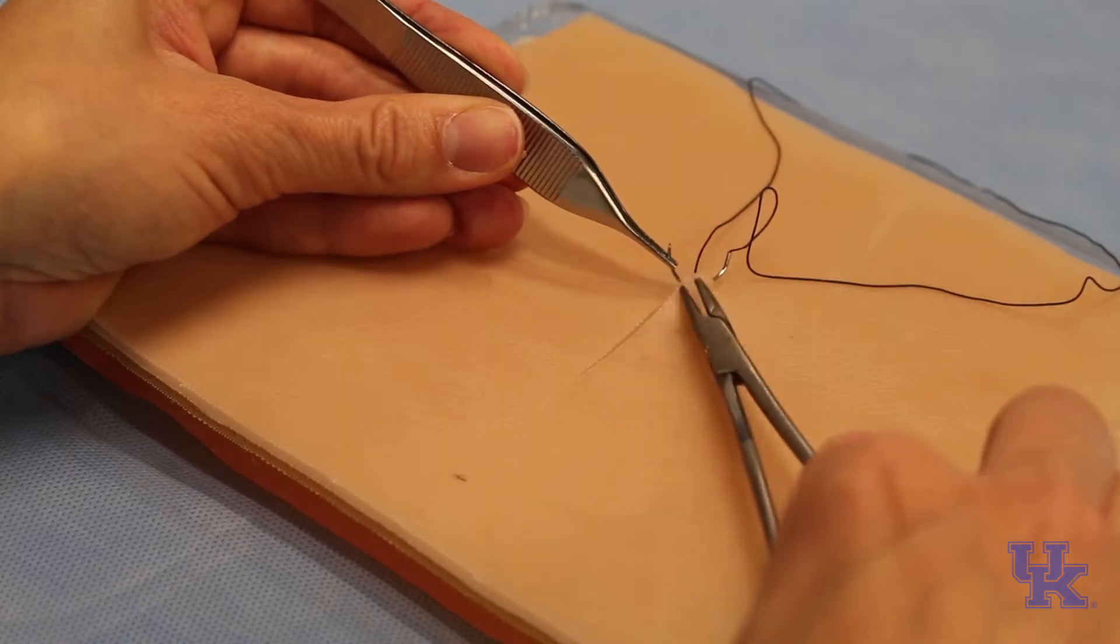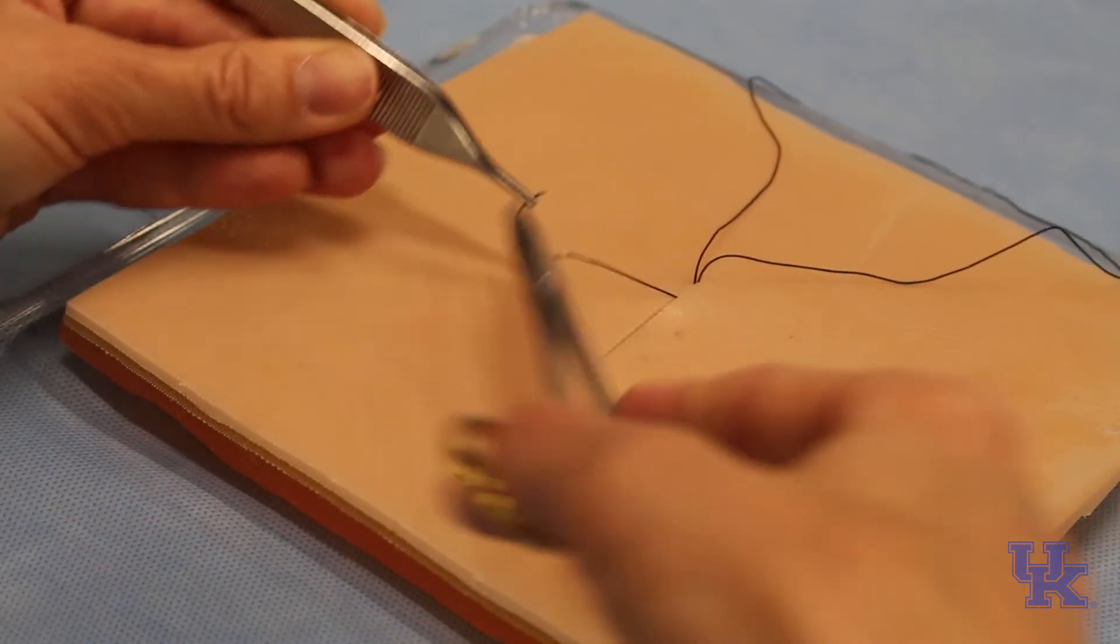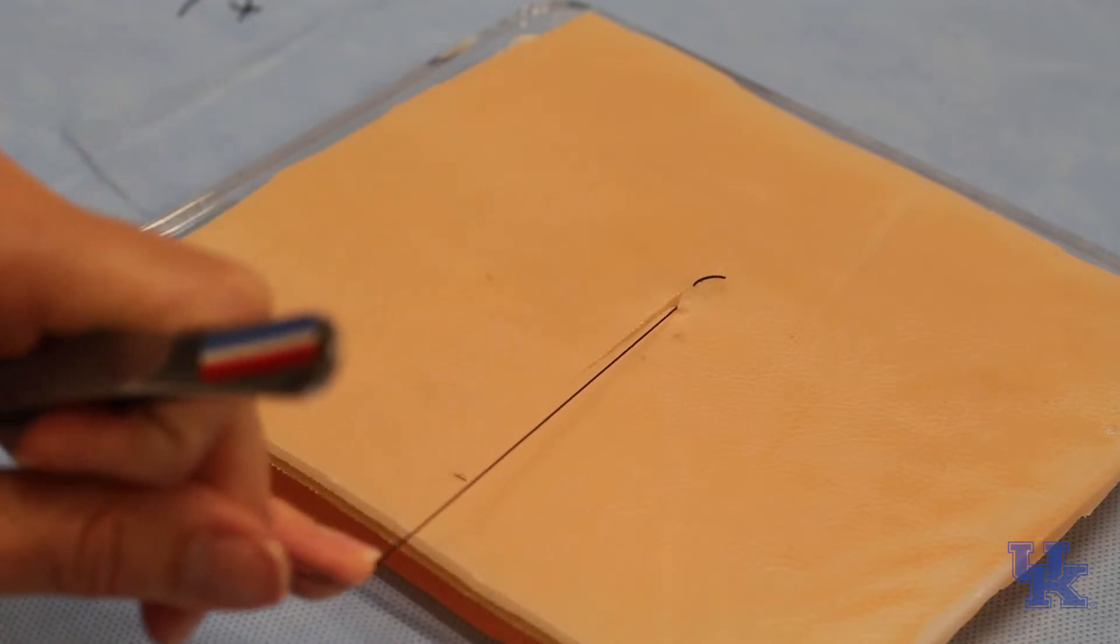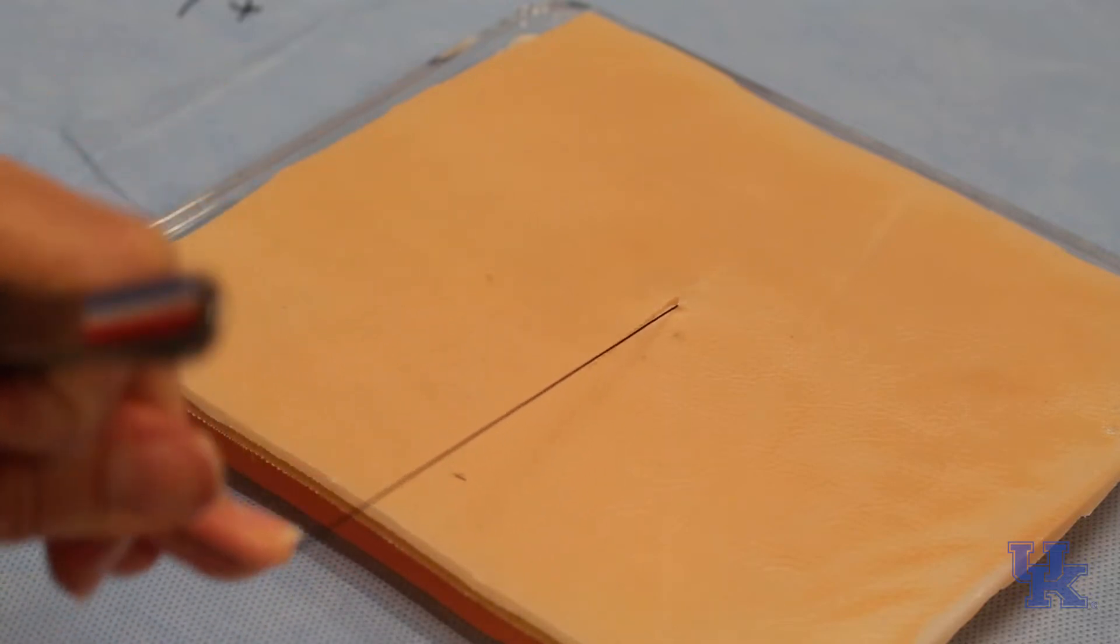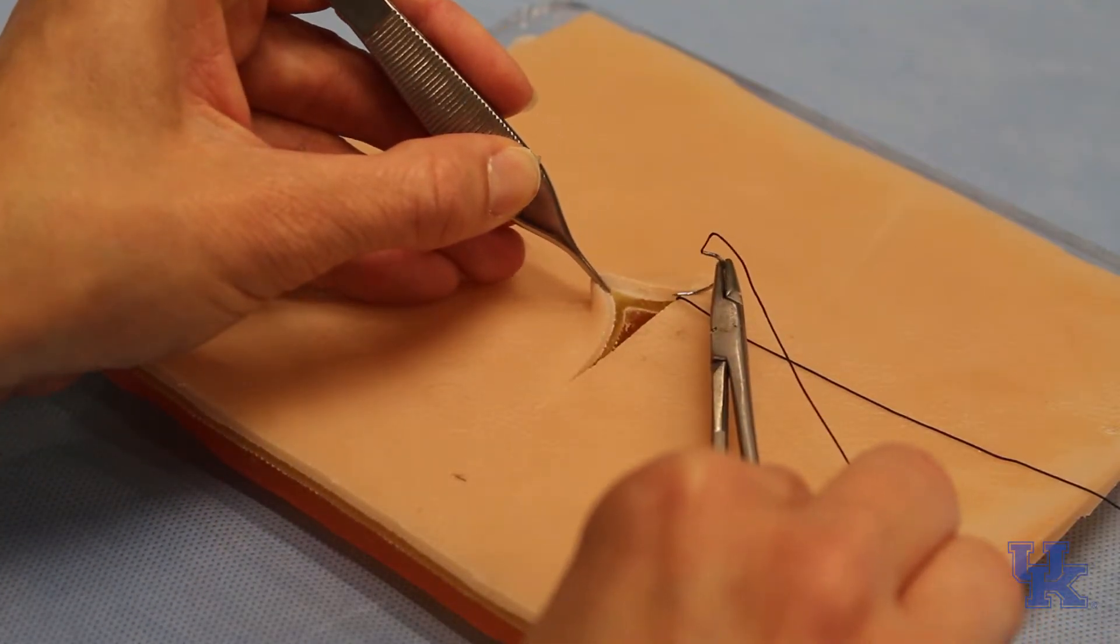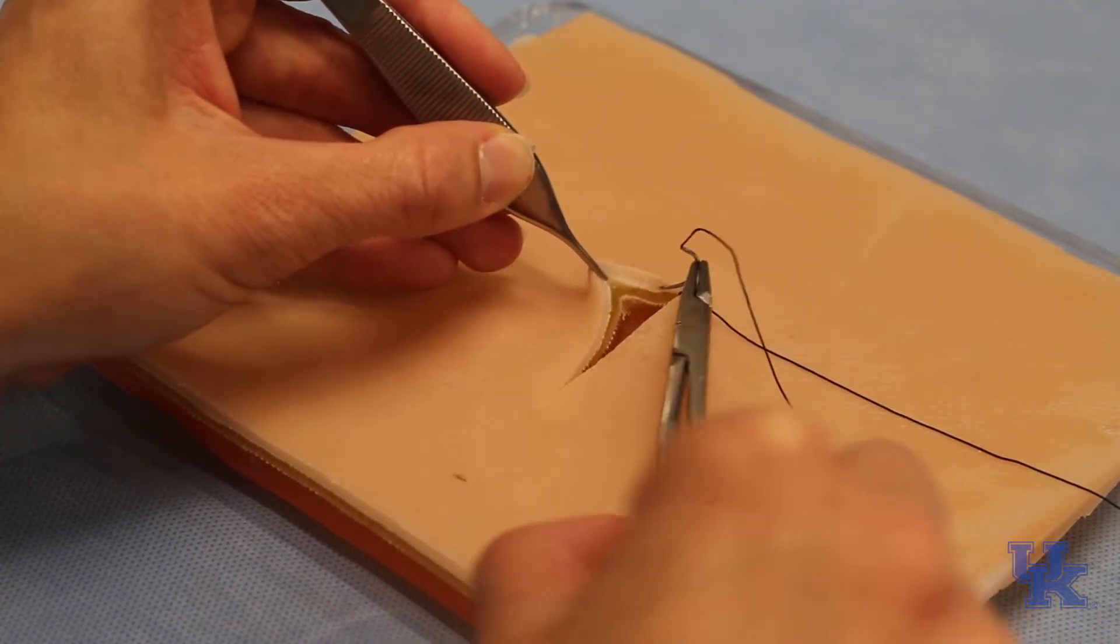You can stabilize this. This tissue is stickier than normal tissue, so it might be a little bit easier and harder at the same time. You're just going to continue to do the same thing. So you want to kind of go across right where you came out. You're going to go into this.